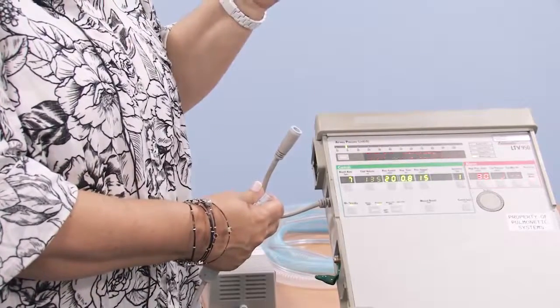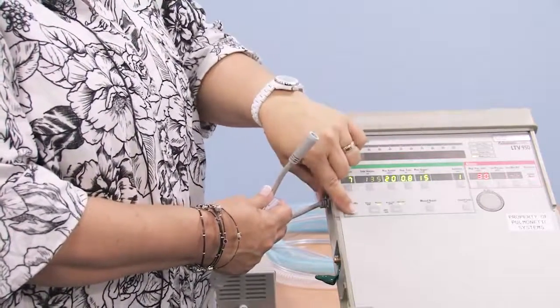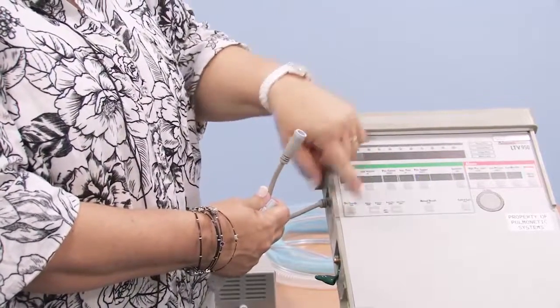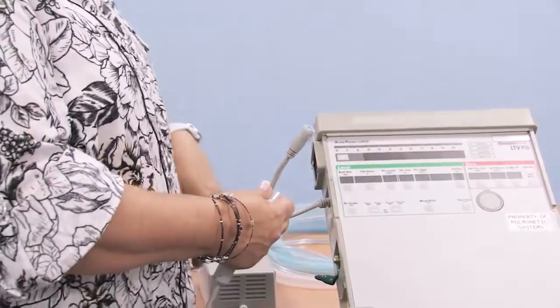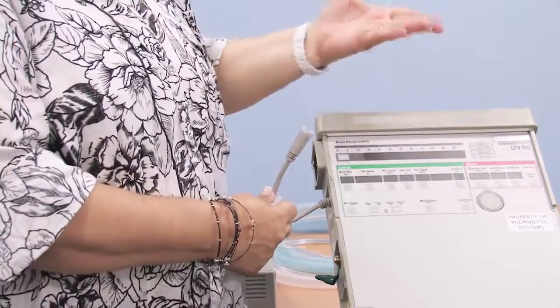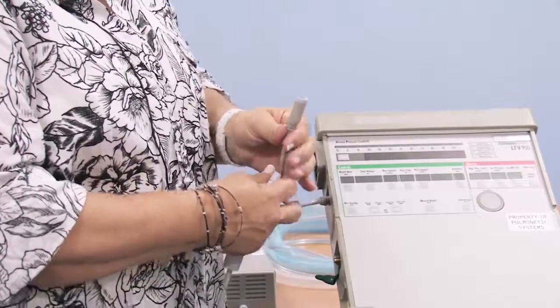It will be an ear-piercing alarm that will not stop until you physically turn off the machine by holding the power button down for 3 to 4 seconds. And that is so that no one can walk by and turn the ventilator off and not have you hear that something's happened to the ventilator on your child.